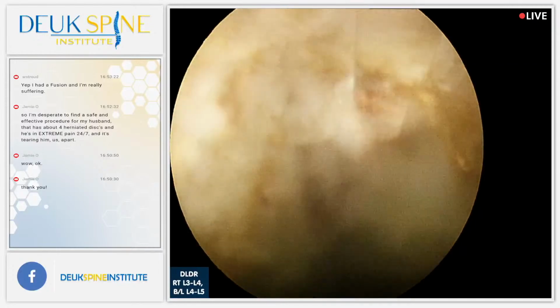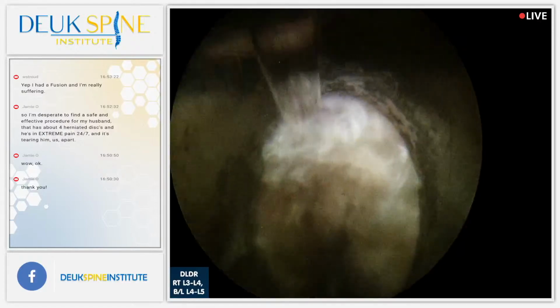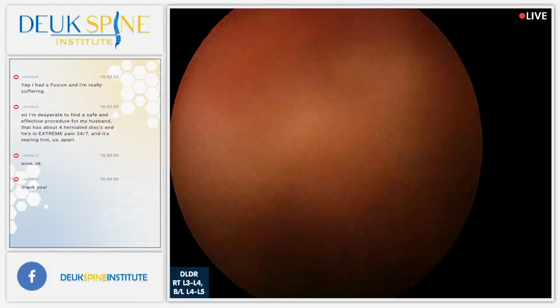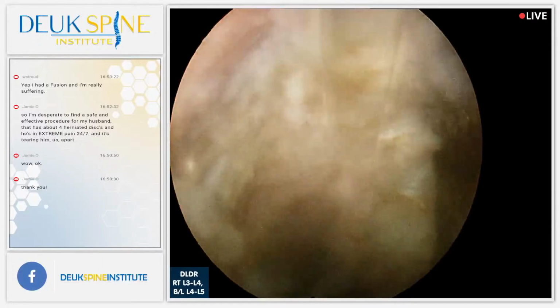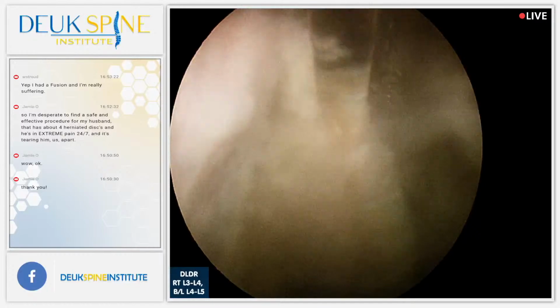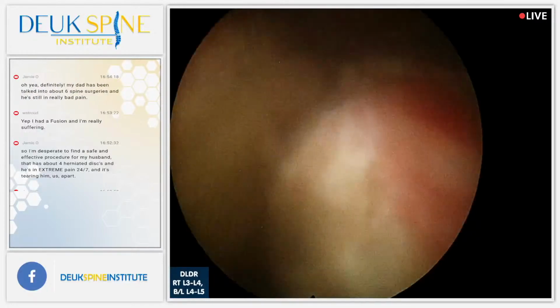All right. Just about done. 30 seconds left. This is looking good. I think we're done here. Just outside the disc, finishing up, removing any herniation outside, right there a little bit, just underneath the nerve. You can actually see the nerve probably.